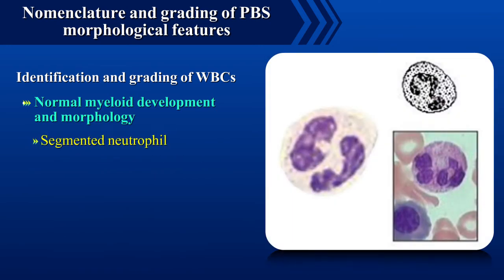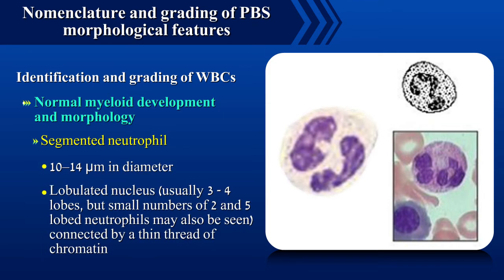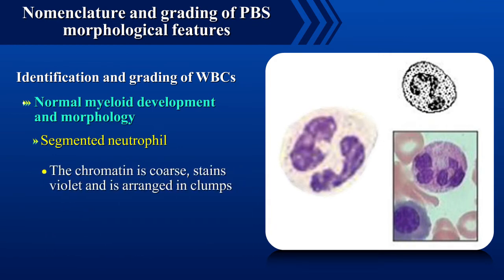Segmented neutrophil is 10 to 14 microns in diameter with a lobulated nucleus usually with 3 to 4 lobes, though 2 and 5 lobe neutrophils may also be seen. The lobulated nucleus is connected by a thin thread of chromatin. The chromatin is coarse, stains violet and is arranged in clumps.